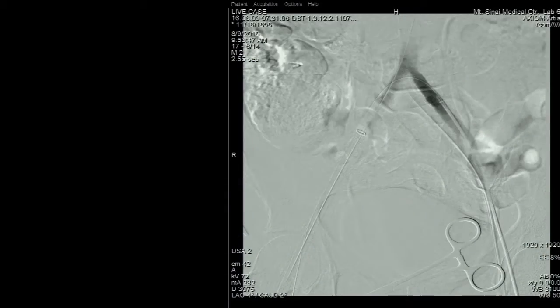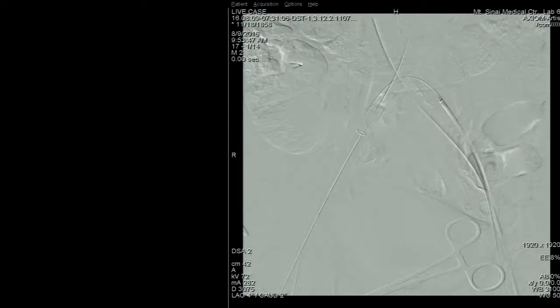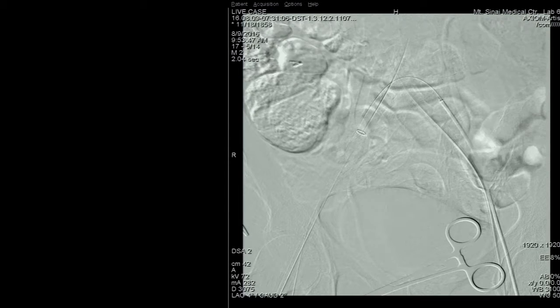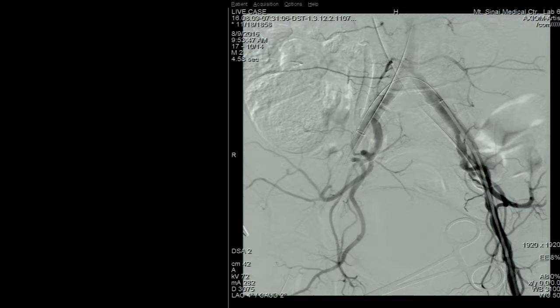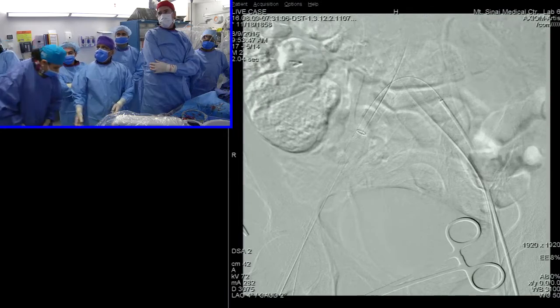Now, JK has finished the groin and will tell us where we are. Just show the angios, please. Great. So we're just getting the sheath out. As you remember, the large sheath was in the right common femoral. What we've done here is withdraw the Solopath sheath to about the bifurcation of the external-internal iliac.